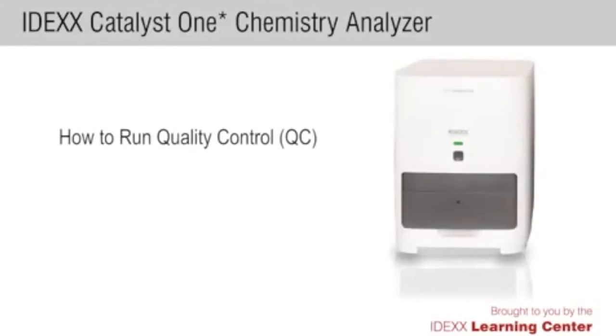In this video, you'll learn how to run quality control on your Catalyst 1 chemistry analyzer.